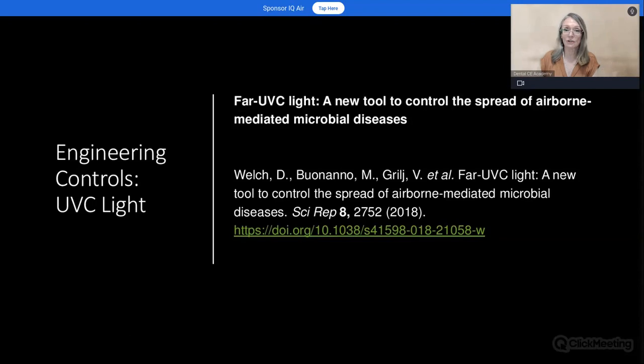So Mary, I actually teach a course on UVC, online and on the ground. And UVC has its advantages and it has its disadvantages. First of all, we can't stare at UVC light. It would destroy our eyes, right? But you'll hear Glory talk about UVC light in HVAC can actually degrade some of your filters and so forth. Number one, not all UVC or far UVC germicidal lighting is equal. And you have shadowing effects as well, right? So it has reduced influenza in long-term care homes.